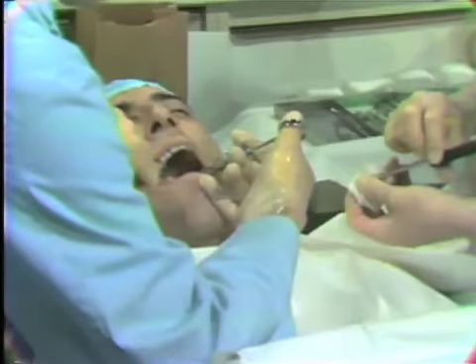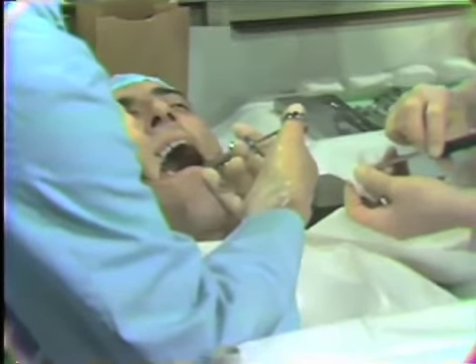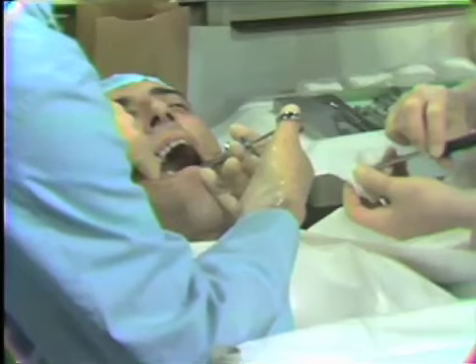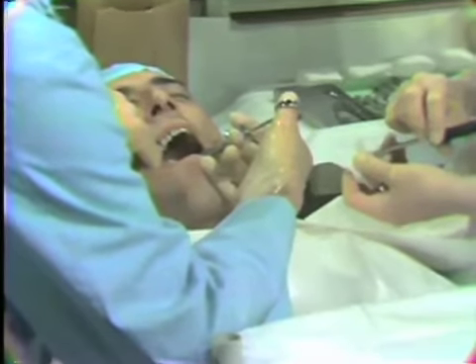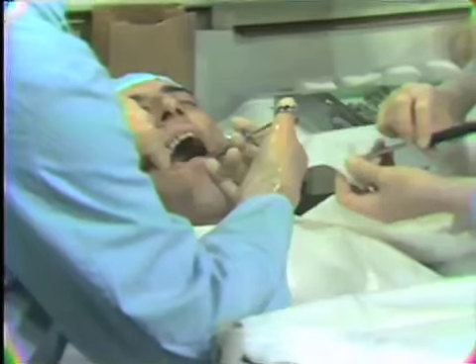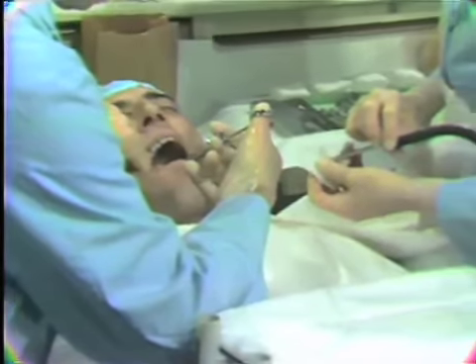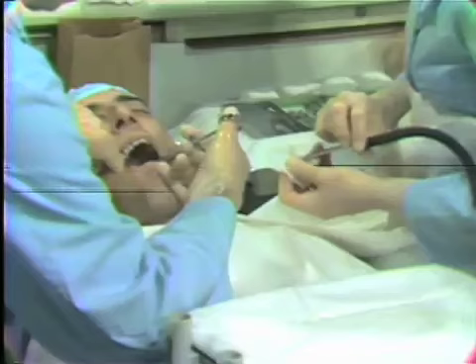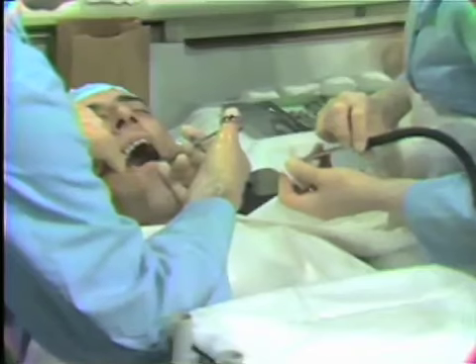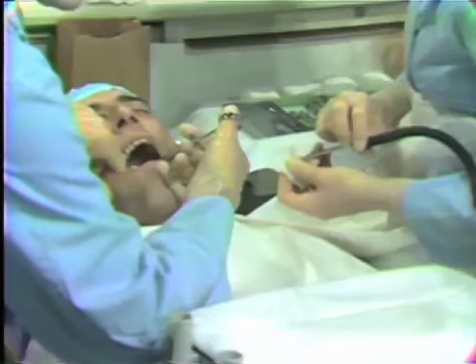The patient's record and radiographs are out, and the patient has been prepared for periodontal surgery with the hair covered, a large drape placed, and the lips and skin area about the mouth have been cleaned. You should also note that the operator and the assistant have prepared for surgery by scrubbing and by putting on a hat and rubber gloves.